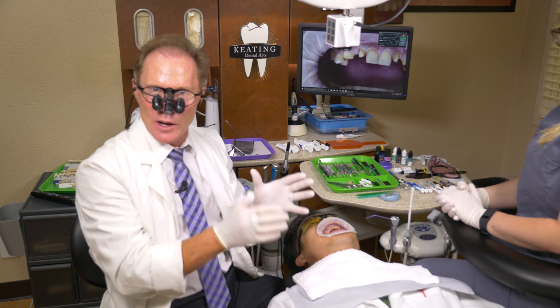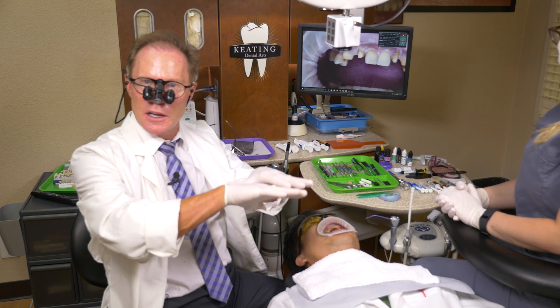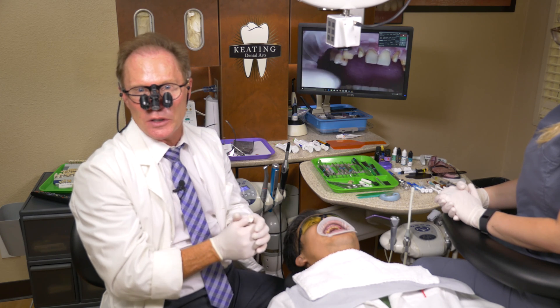Or we did a saddle pontic. The problem with the saddle pontic is that as it wrapped over the ridge, it created a concavity where plaque would trap, and it wasn't healthy — very difficult to clean.